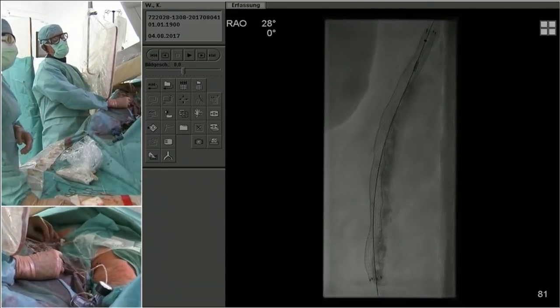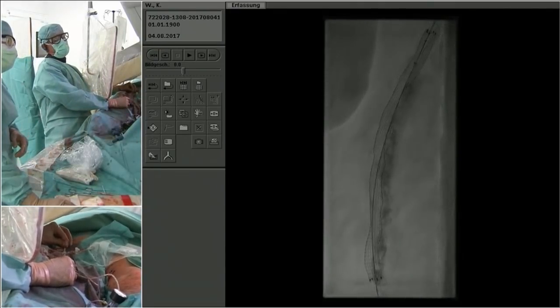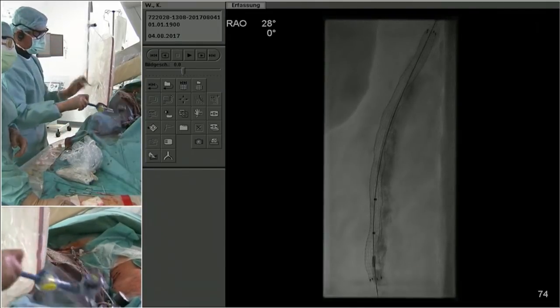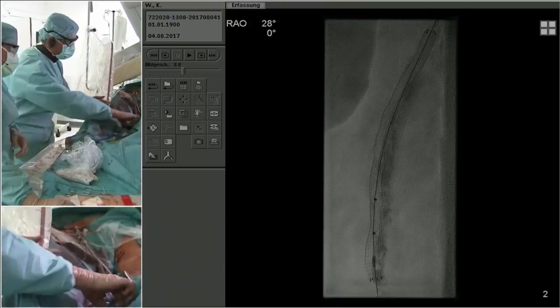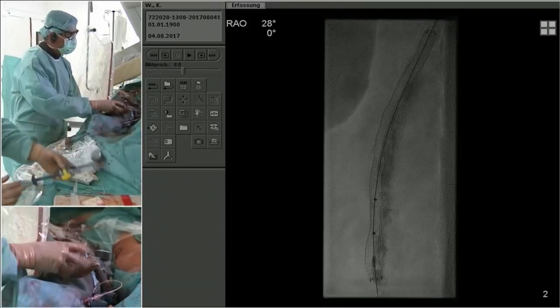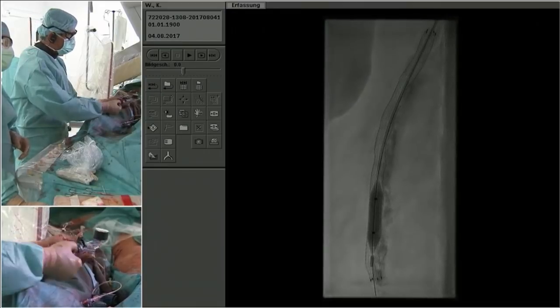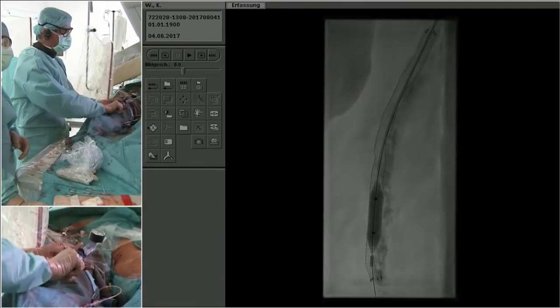Maybe a little more. Actually, the balloon doesn't fit down now. There's no downside. For many of these cases, sometimes it is hard to... Let me give you once again a shot and decide once again. Sure, we'll wait for you. And the rest will be just drug-coated balloon, proximal, distal, maybe Supera in the popliteal artery.